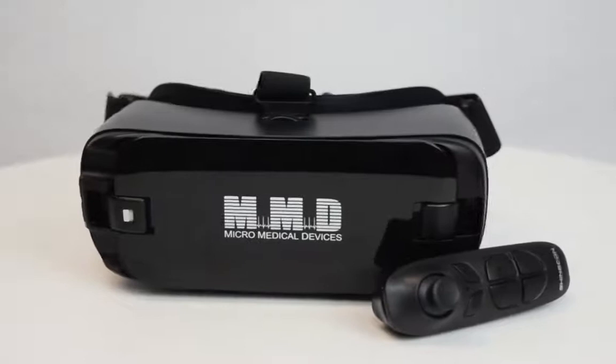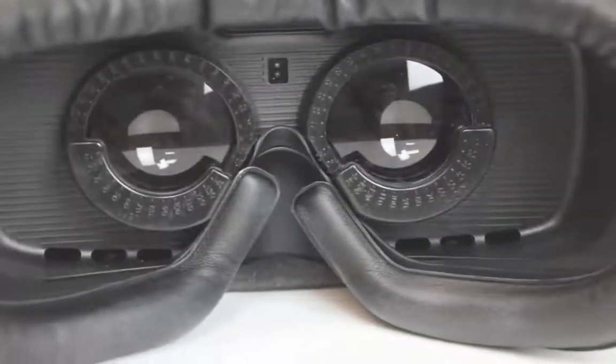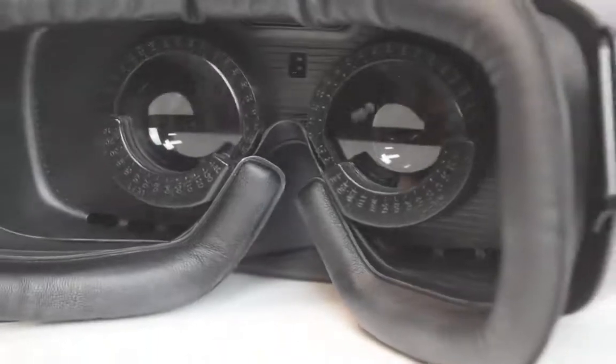Introducing the VF2000 Visual Field Analyzer, the first portable visual field testing device to be developed with your needs and your patient's comfort in mind.